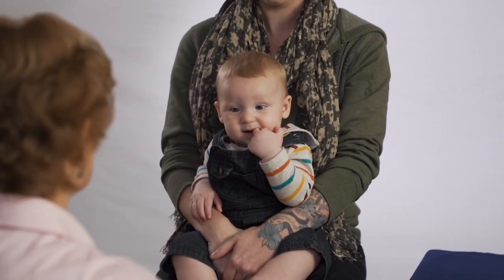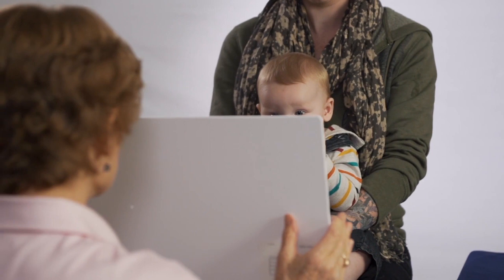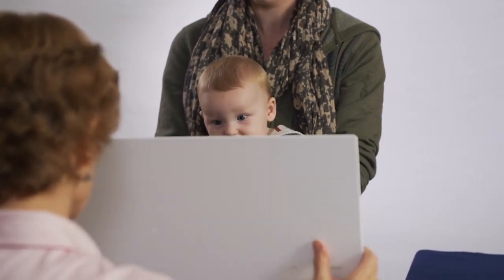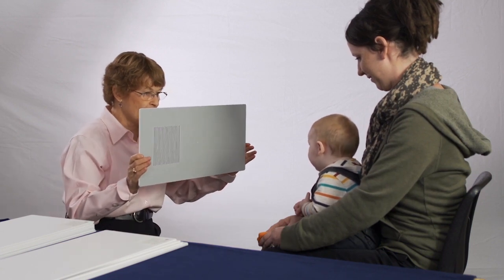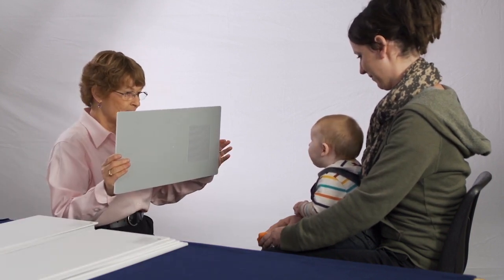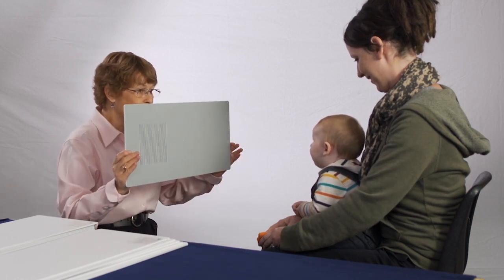The examiner shows the card in one position and makes a judgment as to where the grating is based on the patient's behavior. In this case, the examiner judges the grating to be on her left, the patient's right. The examiner then rotates the card 180 degrees. Now, if the infant's behavior indicates seeing the grating, the examiner should judge the grating is on the infant's left. The examiner should not always rotate the card 180 degrees between presentations, as some patients may anticipate the grating's position. Instead, the examiner should show the grating frequently in the same location.